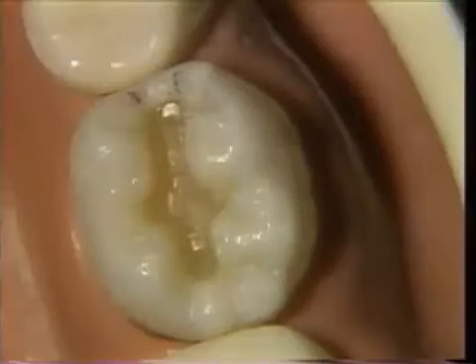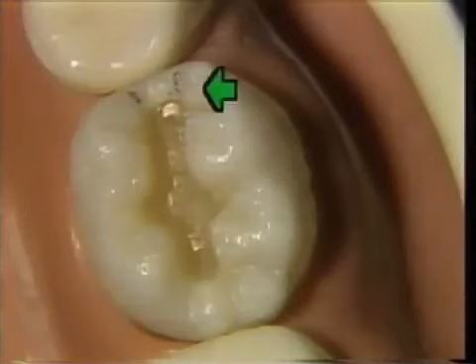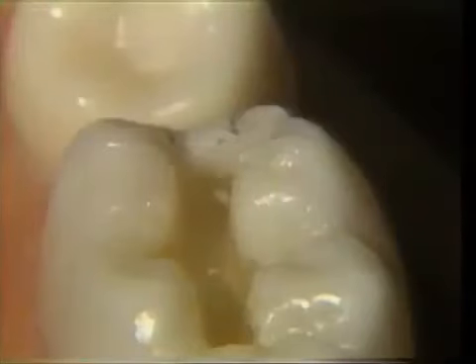The proximal box portion of the Class II cavity preparation should be considered as simply an extension of a Class I. Therefore, before the development of the proximal box has begun, the Class I portion of the preparation should be completed. As an aid for the proper extension of the proximal box, pencil marks should be placed on the tooth surface to indicate the projected buccal and lingual extensions that will be accomplished with rotary instruments.